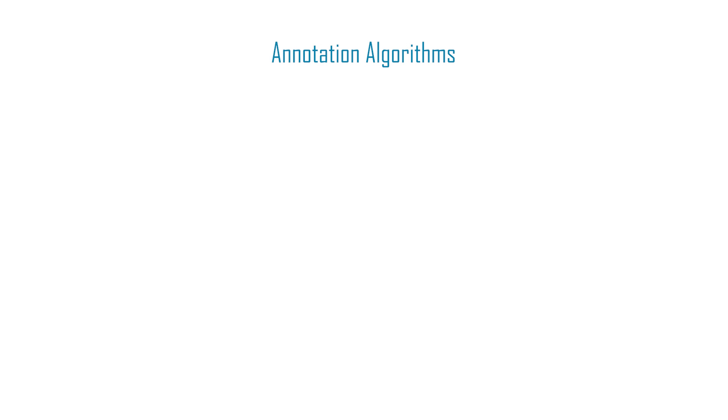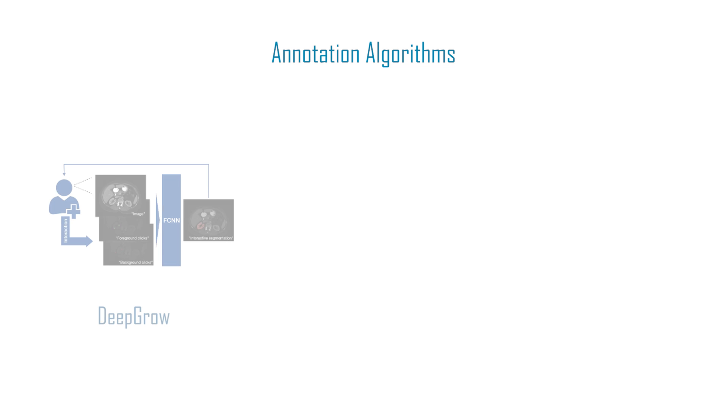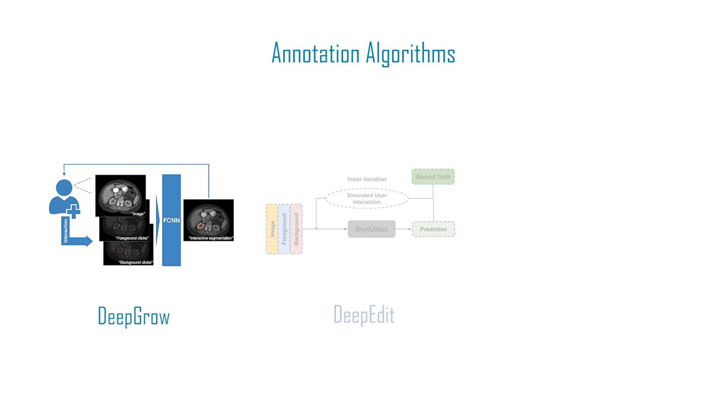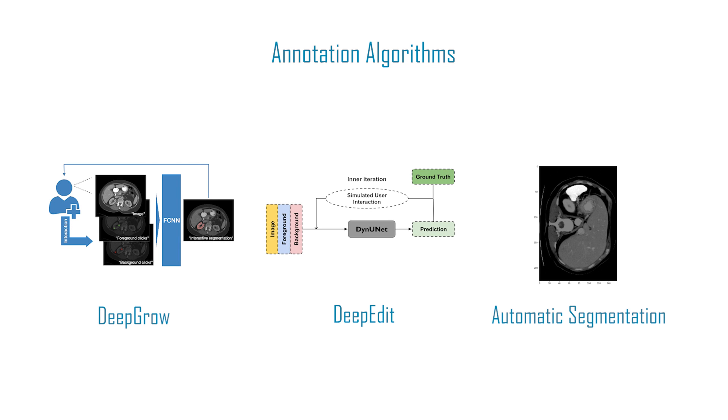MoniLabel currently employs three annotation algorithms: DeepGrow, DeepEdit, and Automatic Segmentation.